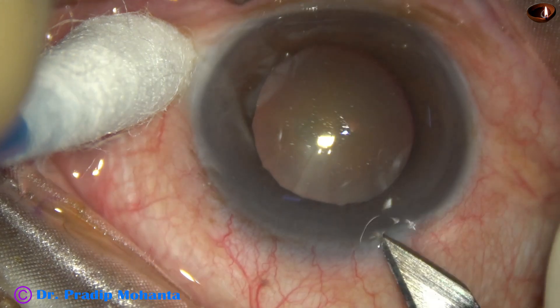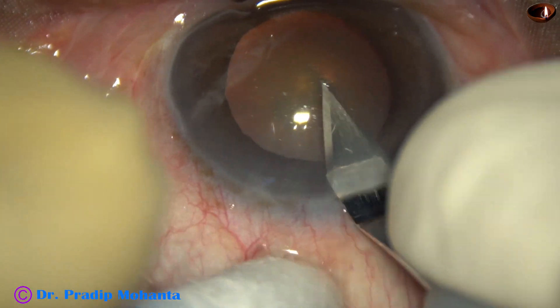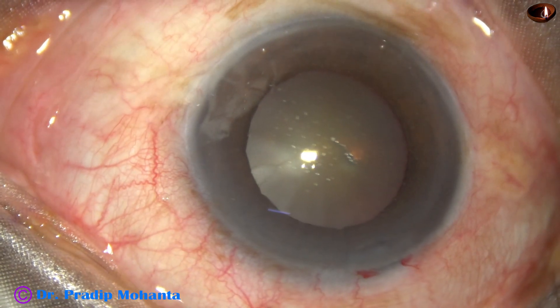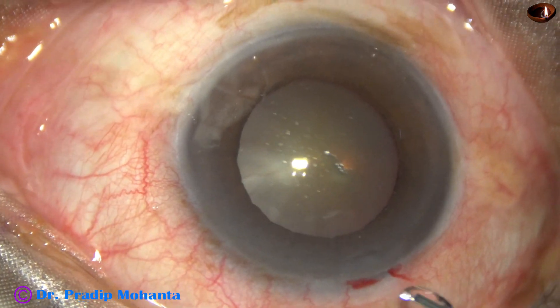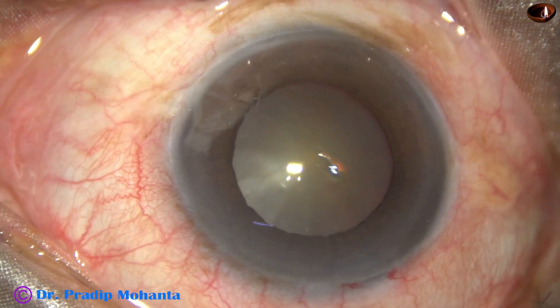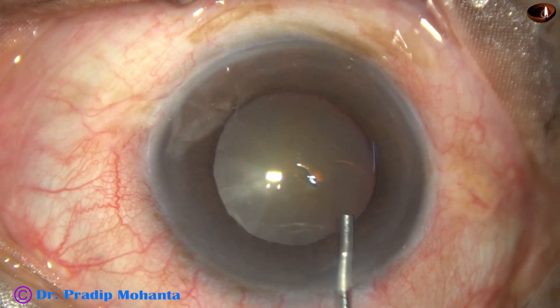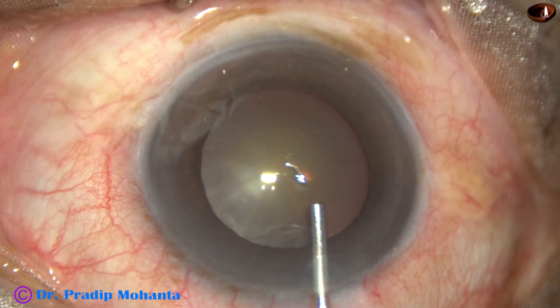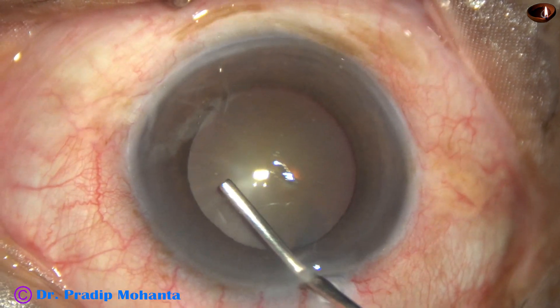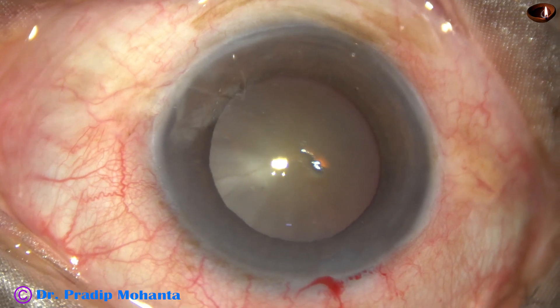This is the main incision with a 2.8 millimeter steel keratome at around 11:30 o'clock. And now, this is a bit of adrenaline to see if the pupil dilates a little bit. Now I inject visco, and with the help of this viscoelastic substance, the pupil dilates a little more.